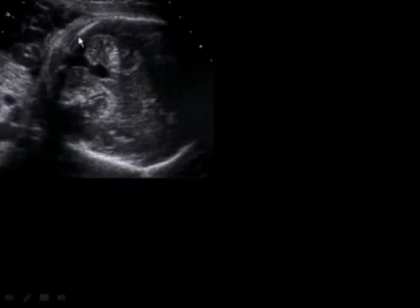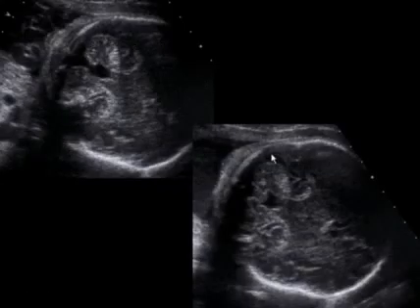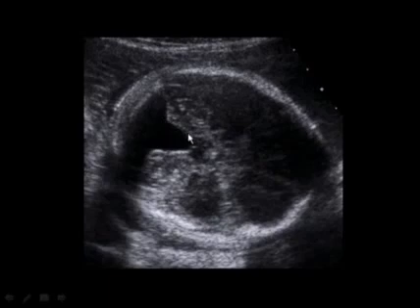And if the probe was tipped so that the calvarium is intact along the back of the posterior fossa, we see, as we do on this image here, that there is indeed a vermis and a distinct fourth ventricle, just in a different spot than was being imaged on the first image. Here's an example of a patient with a true Dandy-Walker variant. The fourth ventricle here is wide open into the cisterna magna, and the cerebellar hemispheres are flattened and distorted, particularly on the superior aspect of this patient with the true Dandy-Walker variant.